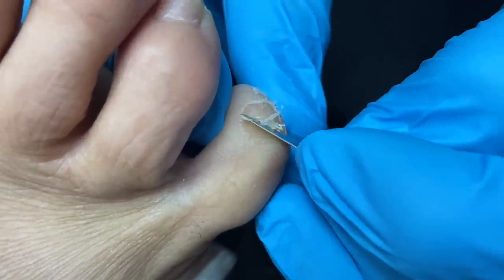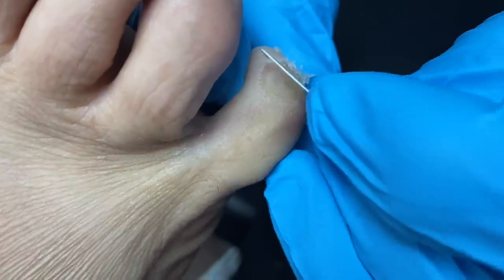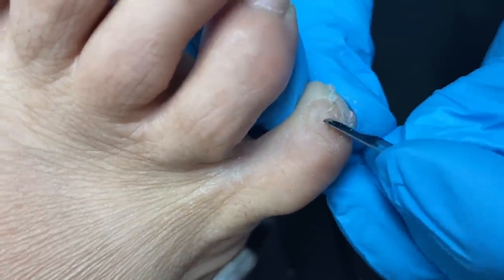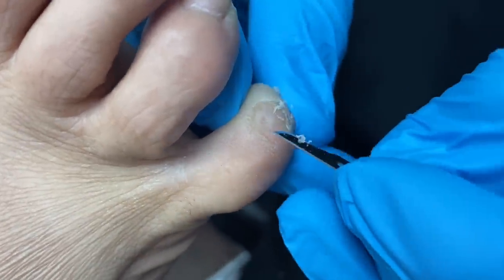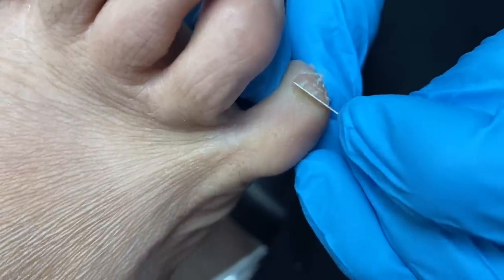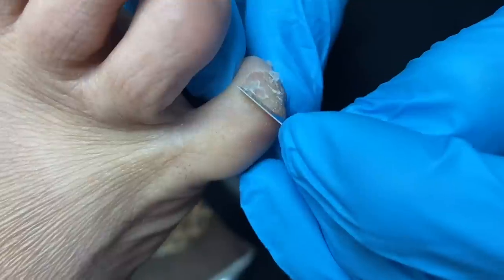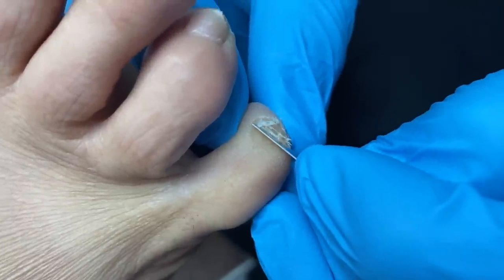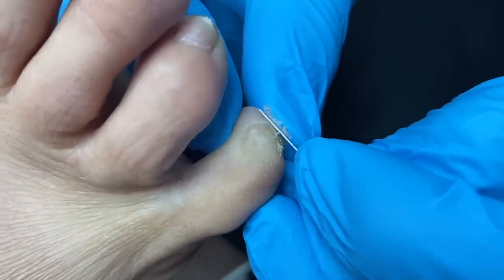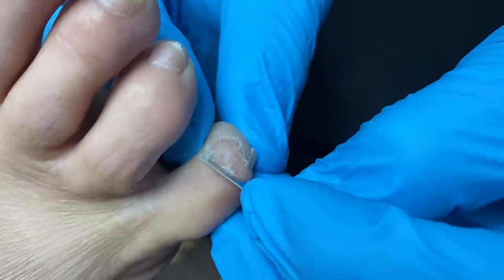I've seen these lesions ulcerate. With respect to prevention, that's the key. This patient is otherwise healthy. What I'm doing right now is just the band-aid — this is not fixing the core problem.